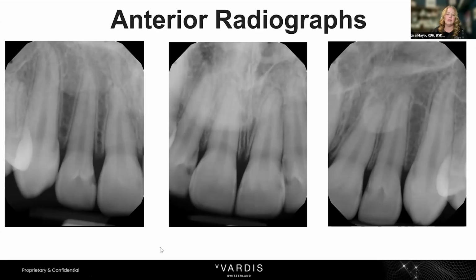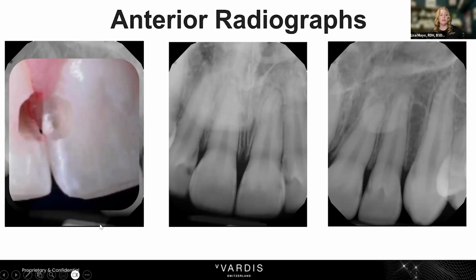So the lateral incisors should be really jumping out to you guys. If you look at the mesial of the lateral incisors and look at the depth of that decay, it was game over on those teeth. We are well through the DEJ and the dentin. And then when Dr. Wynn opened the mesial of the laterals, he got a direct view of the distal of the central incisors, and we were game over there too. In fact, you saw his cavity prep earlier. Here's just a reminder. That's how deep his cavity was between 7 and 8.